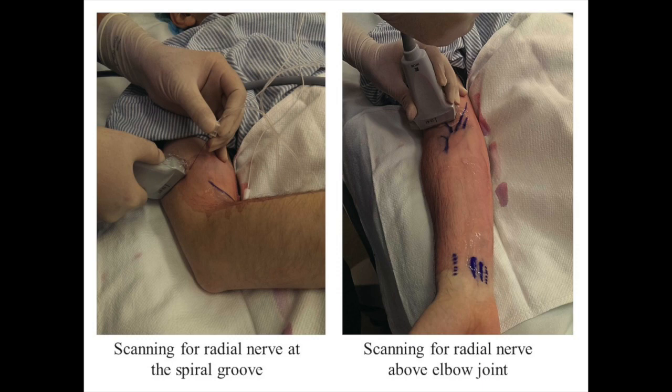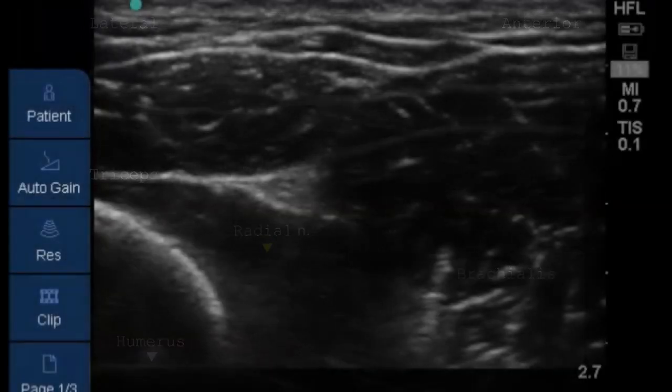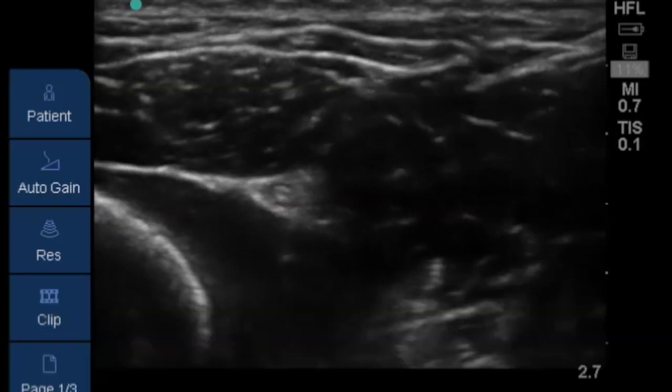A linear transducer is placed near the spiral groove to identify the humerus. Next, upon distal scanning, the radial nerve is usually seen as a triangular, hyperechoic structure coming off the humerus.